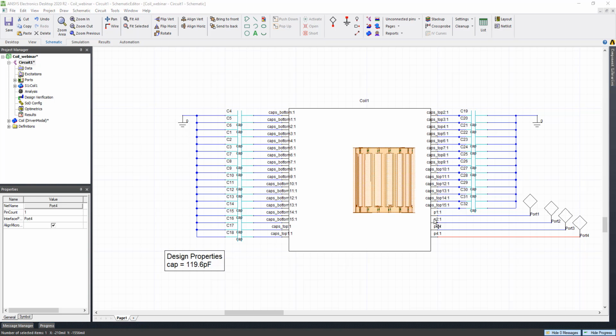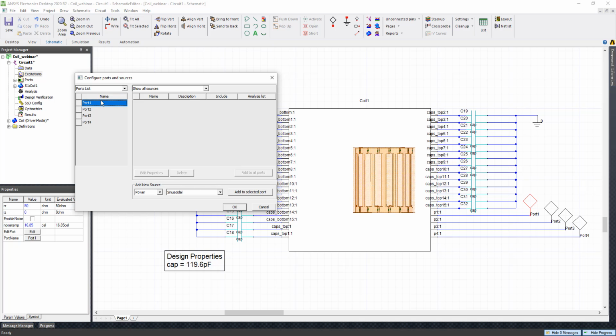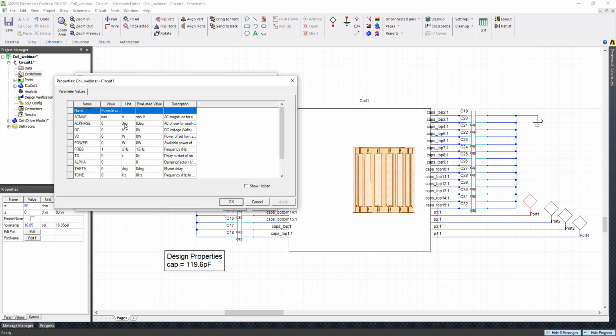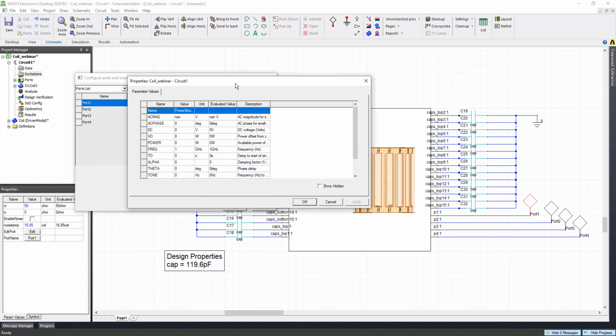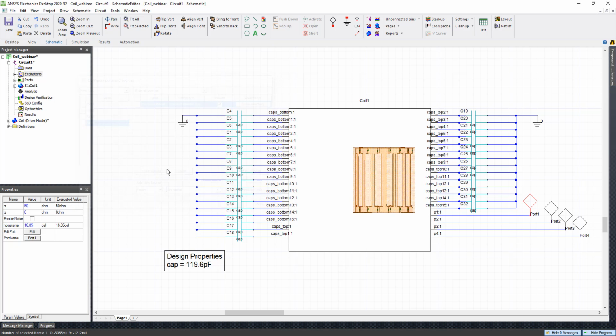All right. So next, if we check all the ports, they look good, then we can go ahead and go to the excitation. We can configure source. For each one, we can add an excitation to each port. So let's say what is the magnitude, I will just put 1 volt. And for everything, I think just leave it as it is, or you can just give it a frequency 33.8 megahertz. That looks good. Yeah, so apply. Okay, then I'll just use the same, I guess.